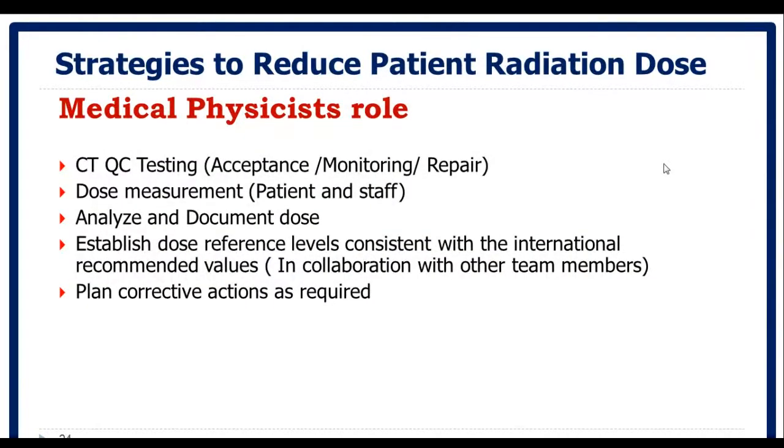The medical physicist is an important part in this journey, and he or she is responsible for quality control testing, starting from the purchase specification, and acceptance testing, critical testing, monitoring testing, repair, dose measurement for the staff, analyzing the dose and documentation of those, in addition to establishment of diagnostic or dose reference levels in collaboration with the other team members, as well as planning any required corrective actions if there are any variations compared to the international recommended values.